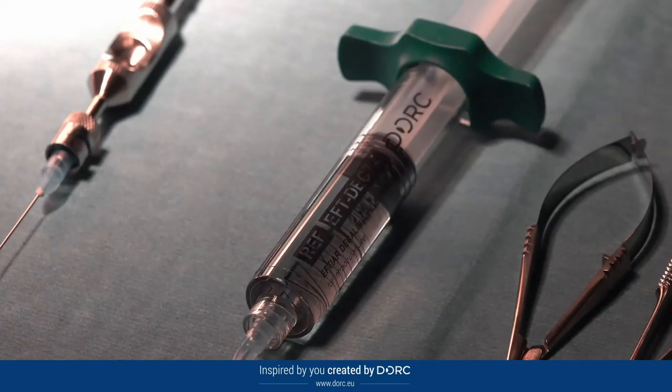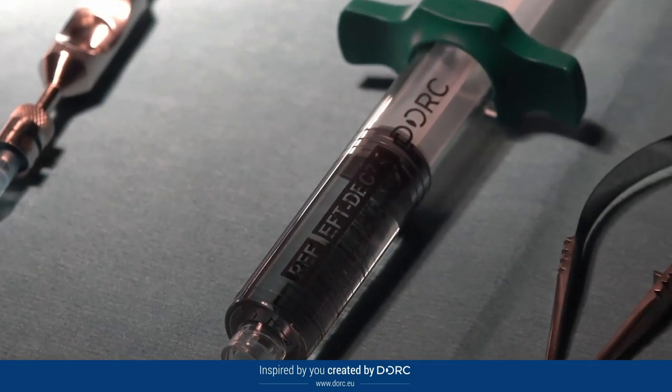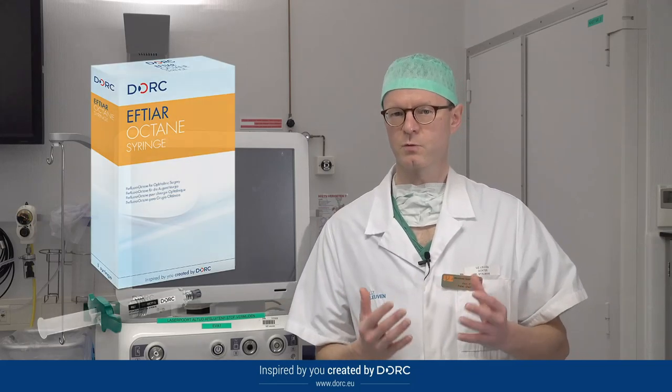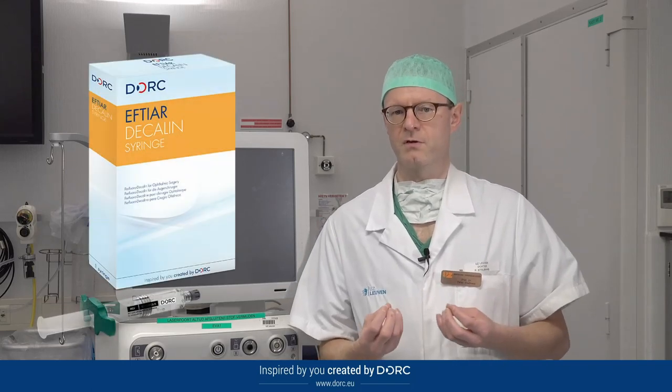Another favorite of mine is the pre-filled syringes of heavy liquid. I use both the pre-filled octane and decane syringes. In fresh acute detachments I prefer to use perfluorooctane syringes because I can better see the leftovers of the vitreous, which make an indentation in the octane. However, for PVR cases where the retina will be more rigid, I prefer the heavier perfluorodecane in these surgeries.